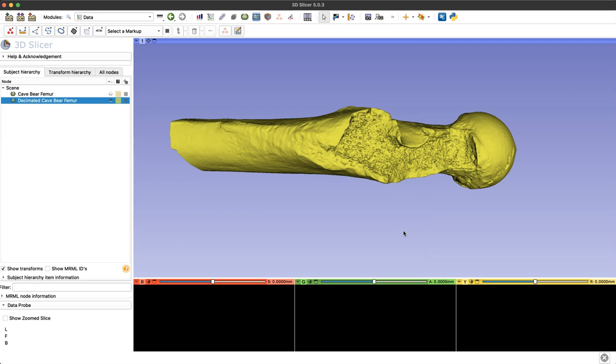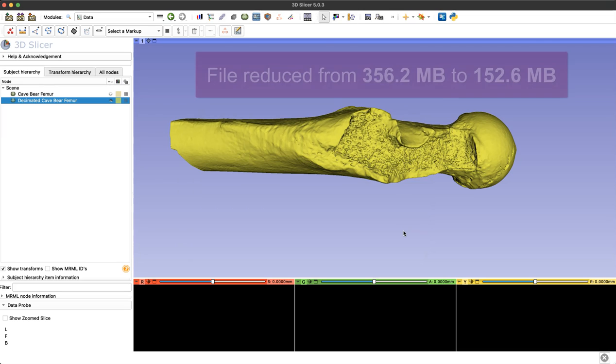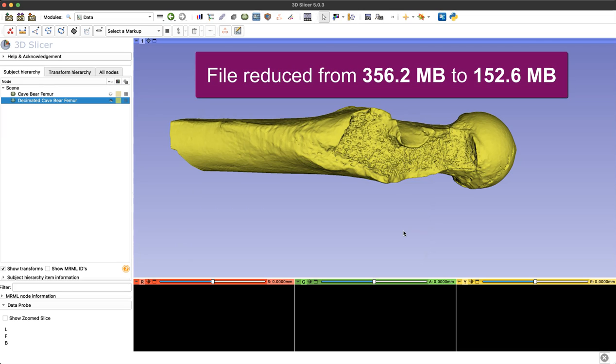Now I've checked our model and our file size was reduced from 356.2 megabytes to 152.6 megabytes.